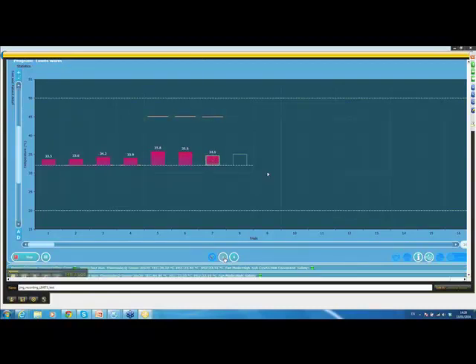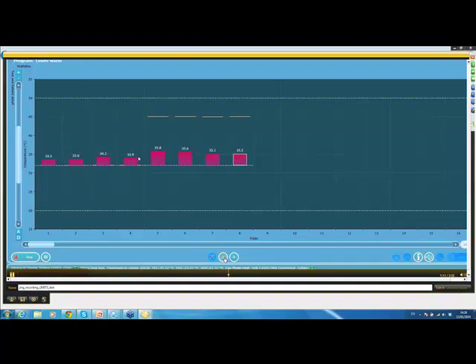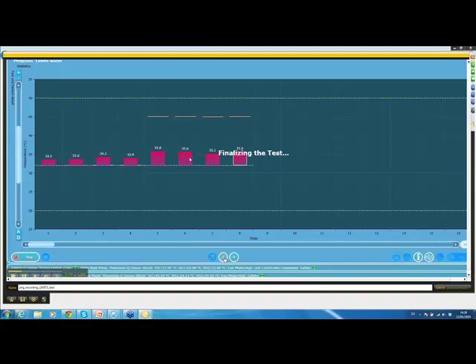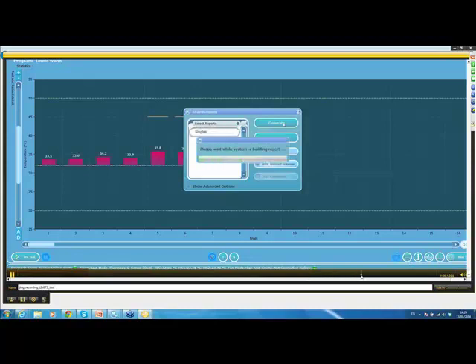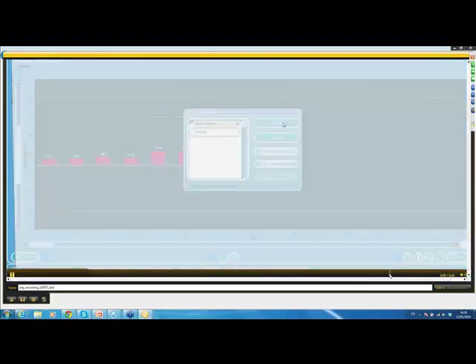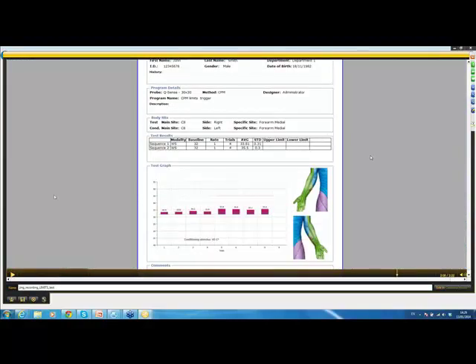You brought an example of sensory threshold. Yes. And in the literature, it should actually be the pain threshold. Yes, but this we did in temperature, as you said, just sensation. Even in sensation, it works. It may also affect, of course, pain. Yes, so it's another paradigm widely used also for heat pain threshold and for pressure pain threshold. Instead of giving a tonic pain or several repetitions of pain, as we saw in the previous example, you just measure the threshold and repeat the measurement during, or simultaneously with, the application of the conditioning pain. And usually we see that the threshold increases. It means that you exert the analgesic response and you need more intensity to get to the pain threshold levels. So definitely it can be a paradigm.